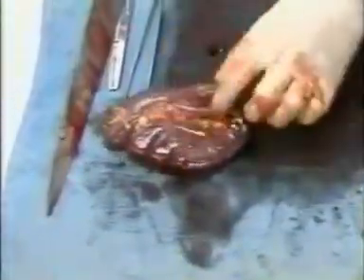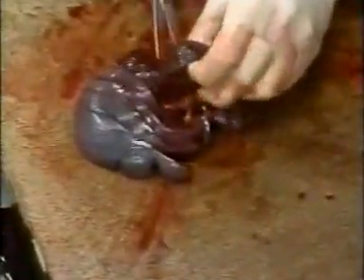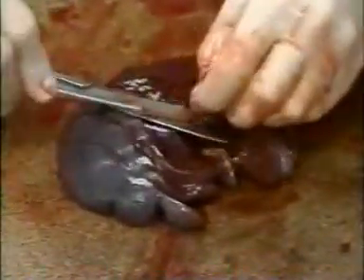This is the spleen, outer surface, and then the inner surface with hilum, which is where the blood vessels enter the spleen. The capsule is intact, thin, essentially normal. The parenchyma, or internal part of the organ, appears a little congested or filled with blood, but otherwise normal.